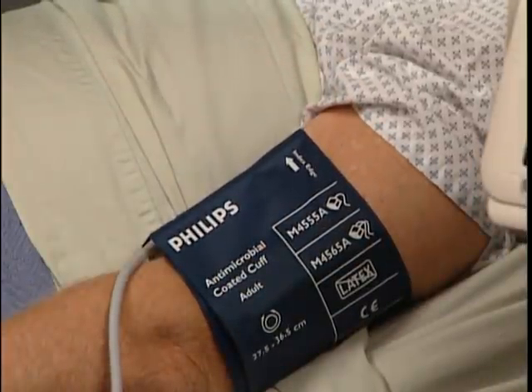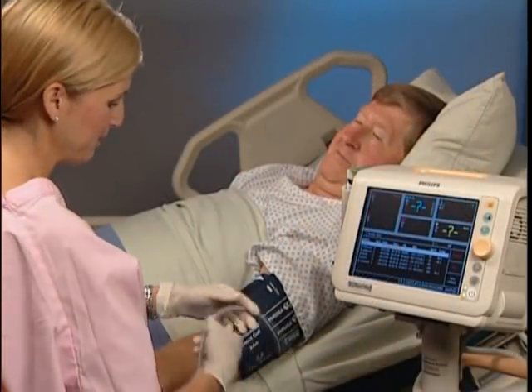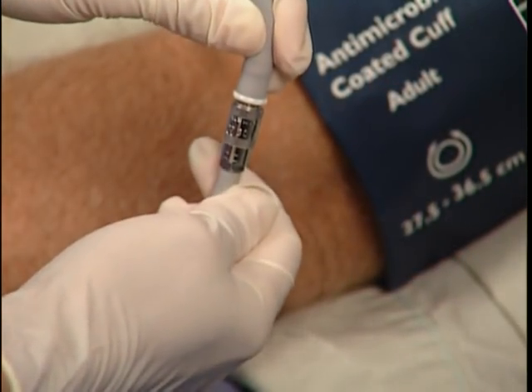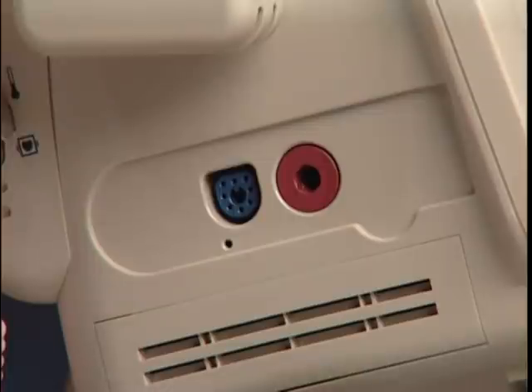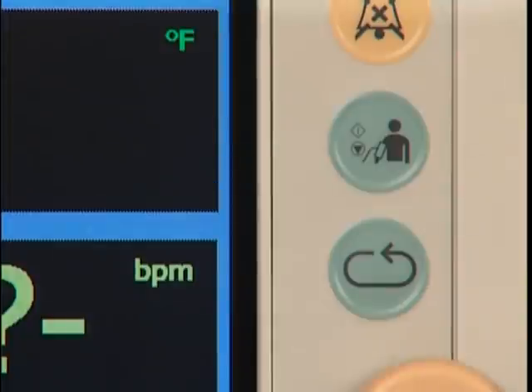Use of an improperly sized cuff can result in inaccurate blood pressure readings. Connect the cuff to the tubing and the tubing to the monitor. Press the NBP button on the front of the monitor to initiate a blood pressure measurement.